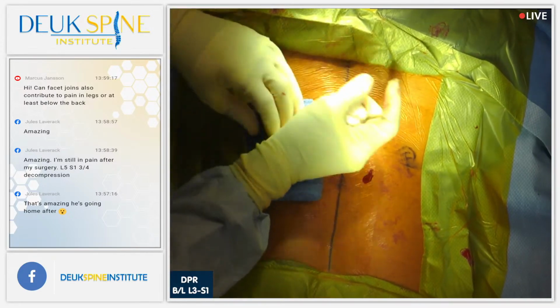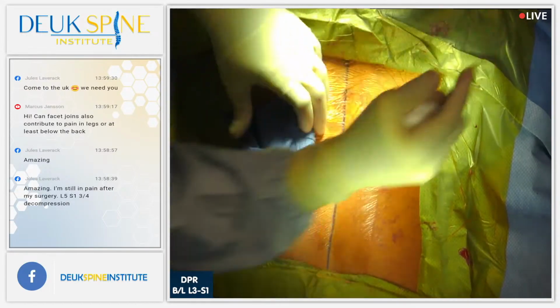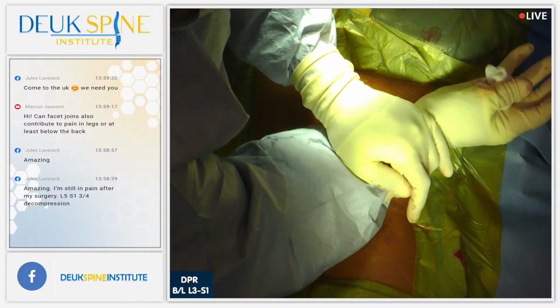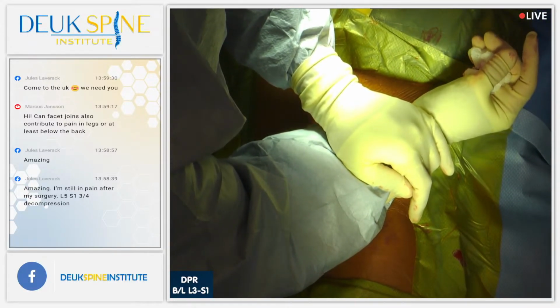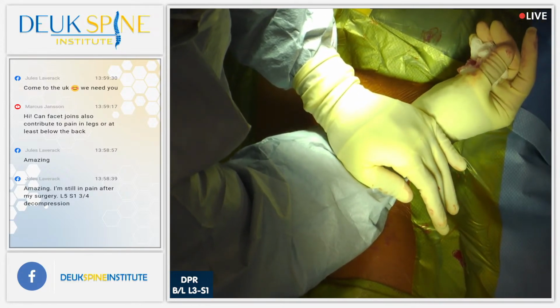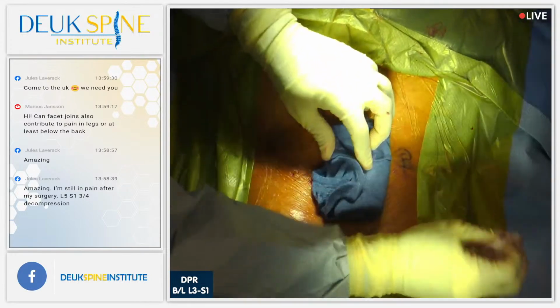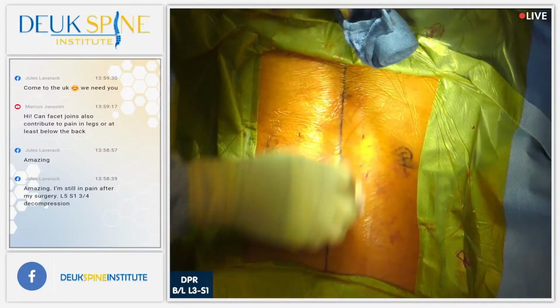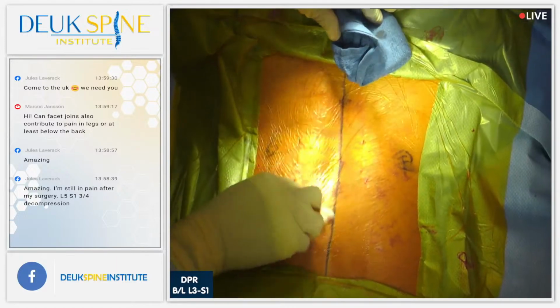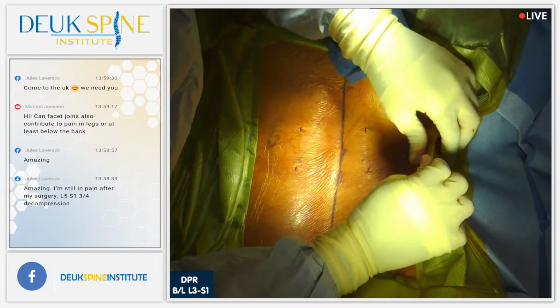So we've developed a more permanent treatment that basically targets the pain nerve in the same place as an RFA, but then we sweep our probe around so that we get a bigger burn area, so we're more likely to burn the bad nerve, the pain nerve. And also we burn with more energy, so it kills the nerve permanently. So we're more likely to hit the nerve and more likely to destroy the nerve permanently with this procedure compared to an RFA. I think in the future everyone will be getting this procedure.